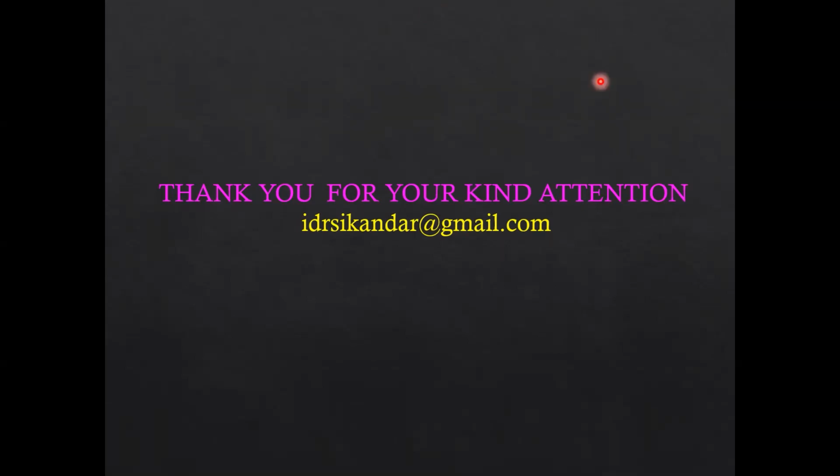There are a couple of questions here. Where do you use technetium-99 MDP bone scan? Technetium-99 MDP bone scan is a routine nuclear medicine gamma camera bone scan.